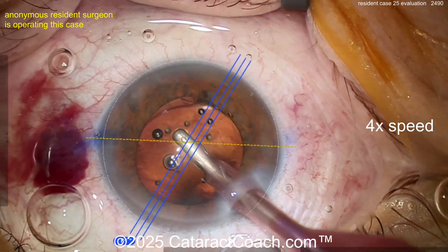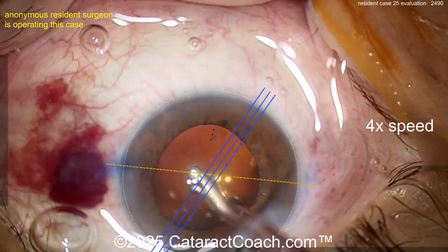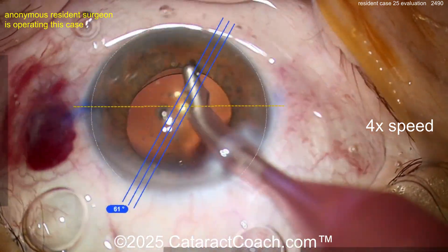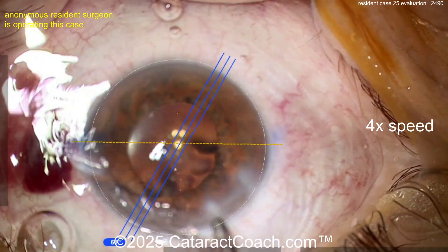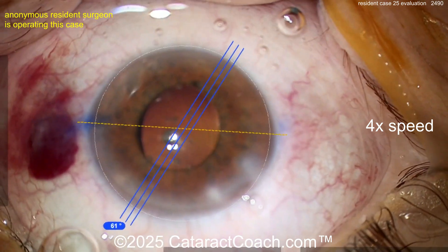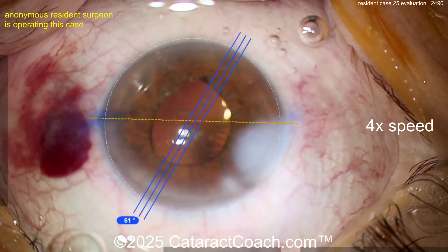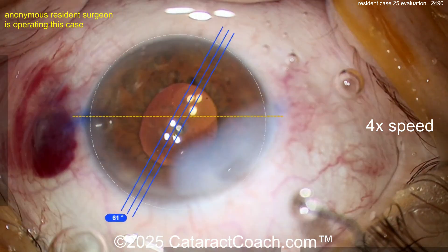With both hands you can lift up the lens, go behind it, or remove the viscoelastic. It's a toric lens for sure — it's not appropriately lined up just yet. You want to go behind the optic and remove the viscoelastic. Using a toric lens is kind of early in your career — you need to be able to go behind the optic and remove the viscoelastic.